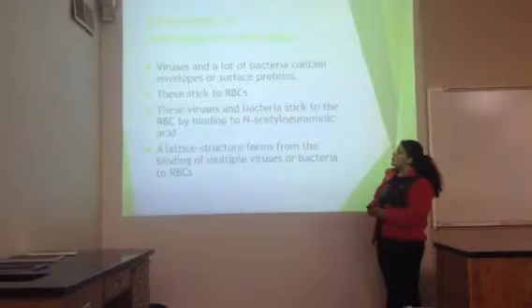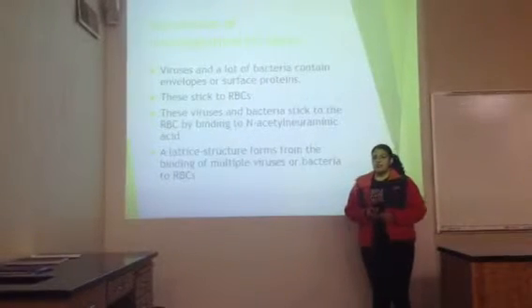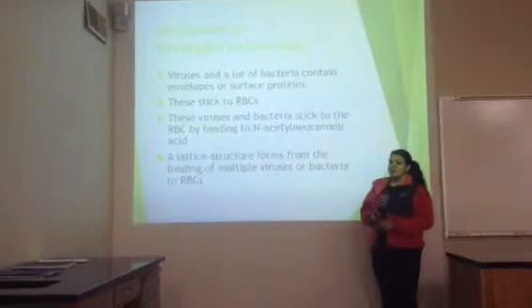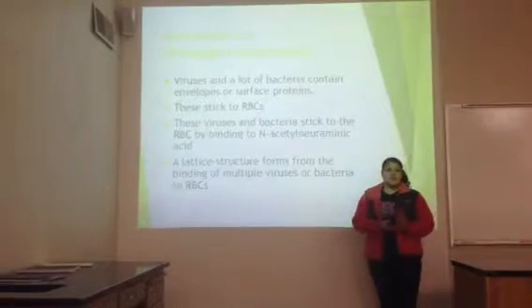Viruses and a lot of bacteria contain surface proteins and envelopes, and this is what actually sticks to the RBCs. These viruses and bacteria bind to N-acetylneuraminic acid. And like I said, that's what causes the binding.